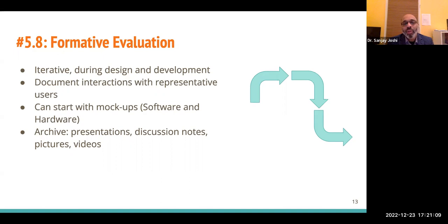When we talked about software mockup, I remember the very first version, it was me and my boss. We literally did it on PowerPoint. That's it. We said, here is the screen, here is how you click on the next button and it will take you here. Does the workflow on the user interface make sense? This was before we wrote even a single line of software. And this is very quick. You can get user feedback very quickly on what makes sense, what doesn't make sense, what could be too confusing. And the surgeon says, no, I'm never going to do that in the operating room.